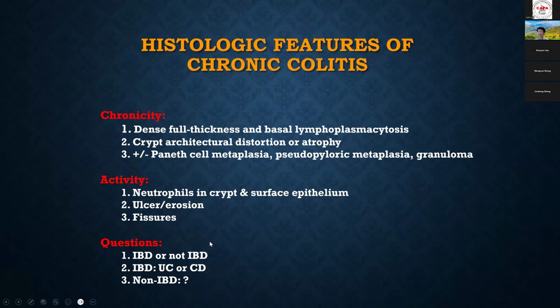Okay. So once we determine the biopsy is either chronic or chronic active, the next question is: is this IBD or not, right? And if that's IBD, is that Crohn's or is that UC? And if that's non-IBD, what is that, right? So today I'm going to discuss all of these questions.